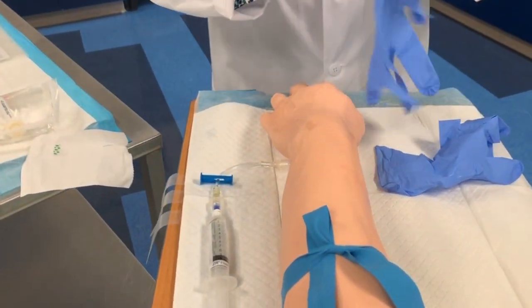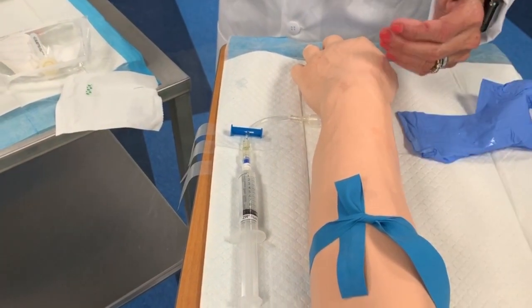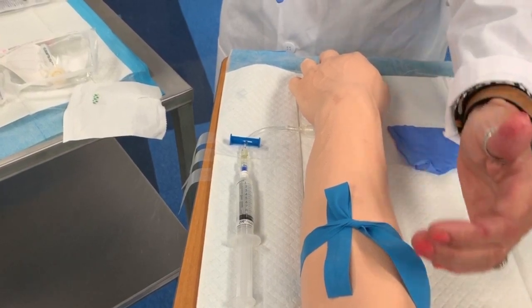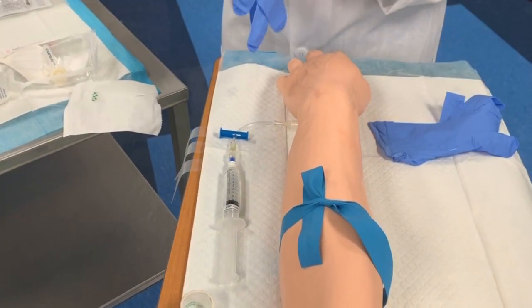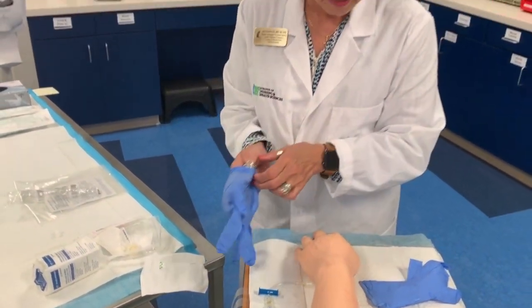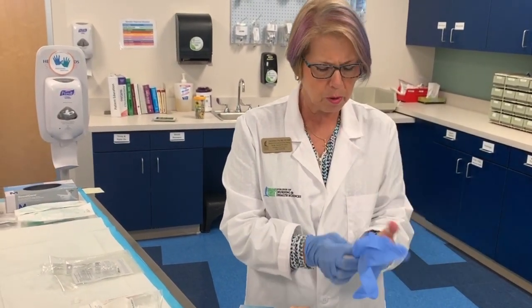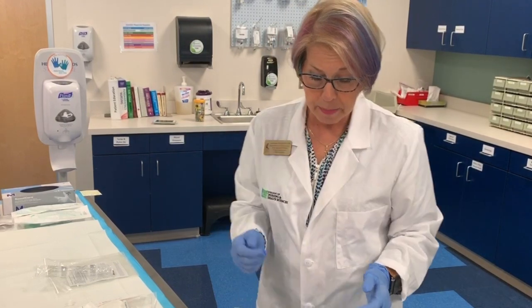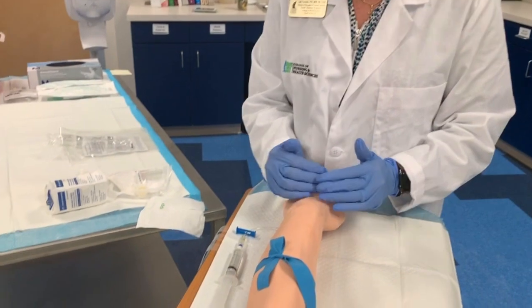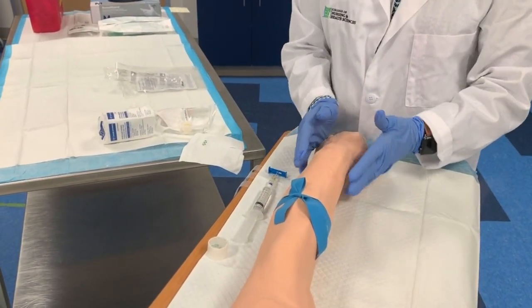As we choose our sites and you begin sticking, remember we want to start more distal than proximal to our patient here, because if we do miss the IV or infiltrate, we're going to need to go higher. So you don't want to start way high because then we're kind of stuck. In the preoperative setting, oftentimes we may start with the hand, or sometimes in the ER as well, when we're looking at more short-term IV usage. But during this phase of the patient's stay in the hospital, I like to use the forearm area and not the hands or the antecubital, because that allows the patient to use their arm and their hands really well.